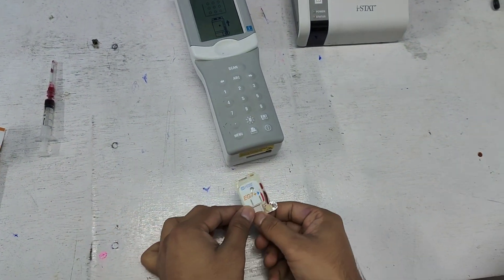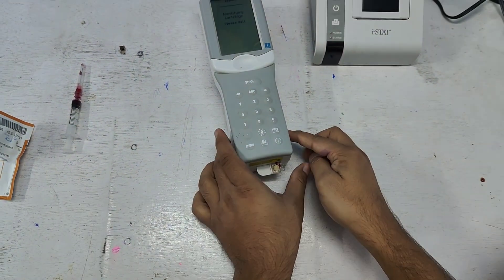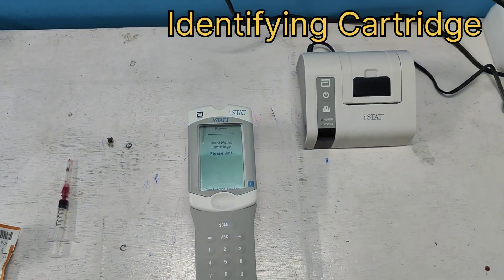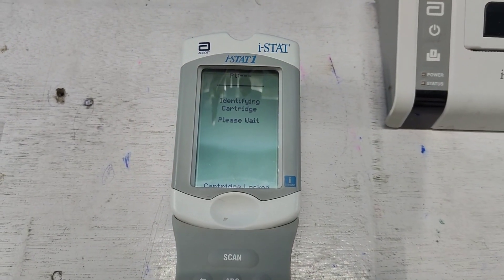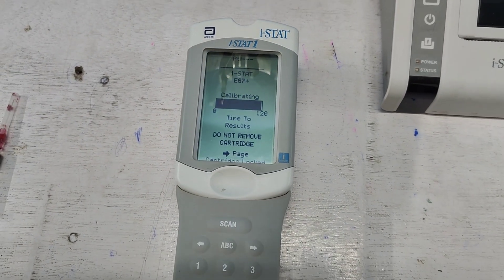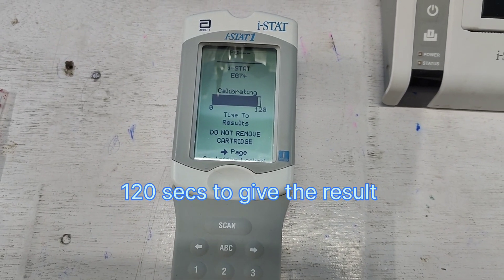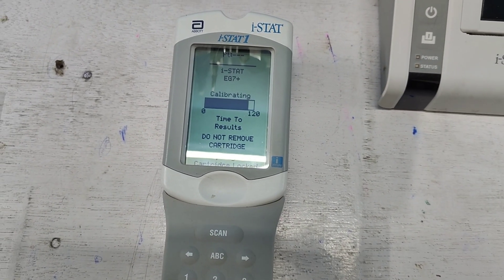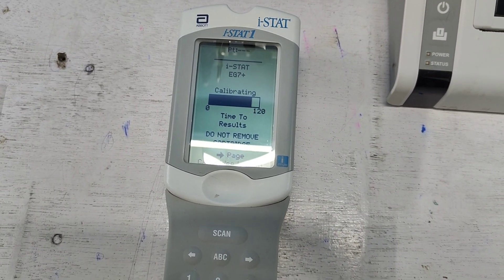Now let's insert the cartridge into the machine. The machine says 'identifying cartridge, please wait.' The cartridge is locked. It now shows the time — calibrating, 0 to 120 seconds. Time to result: do not remove the cartridge during this process. Let's see what happens after 120 seconds.